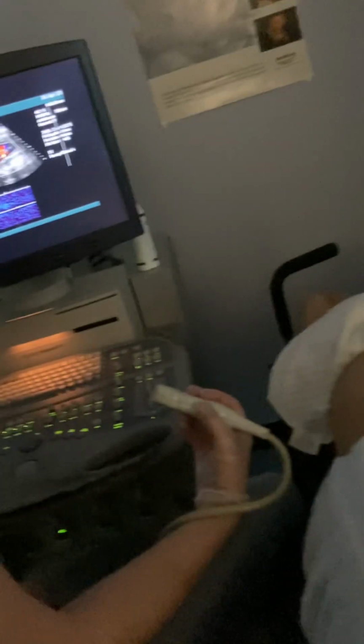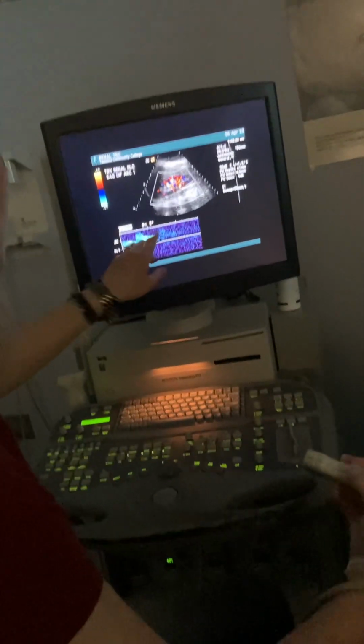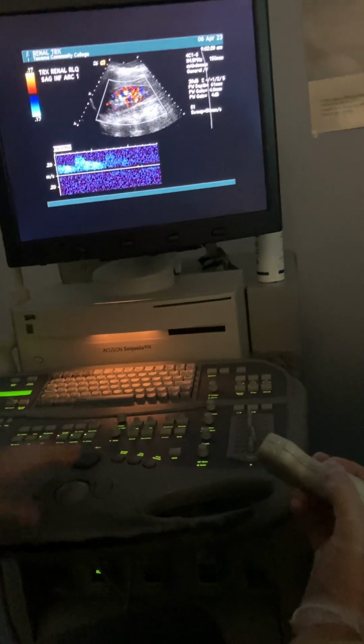And is that how you know, the degree measurement is how you know that it's pointing basically straight toward the transducer, or? Yeah, and visually. Okay. So if I take this off, it's going to be visually.